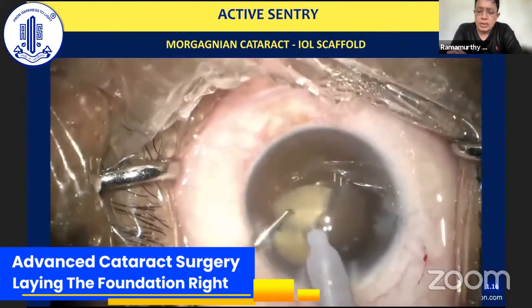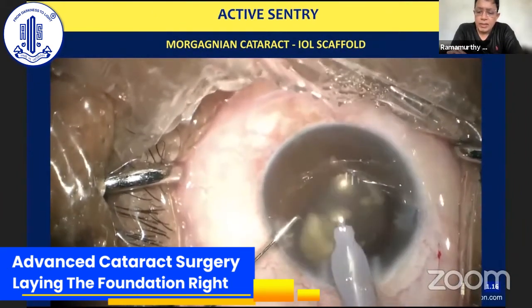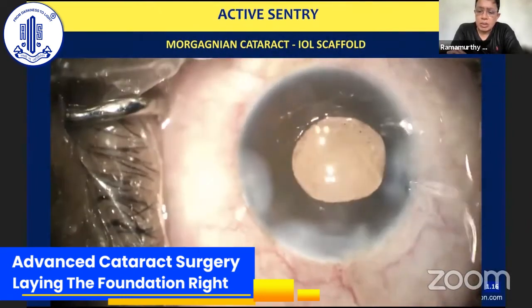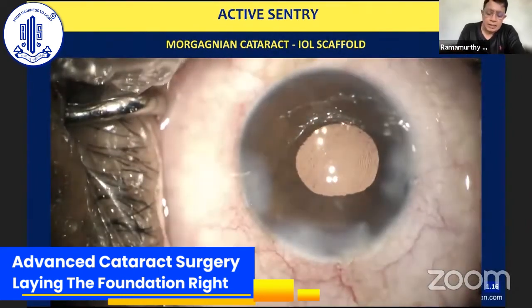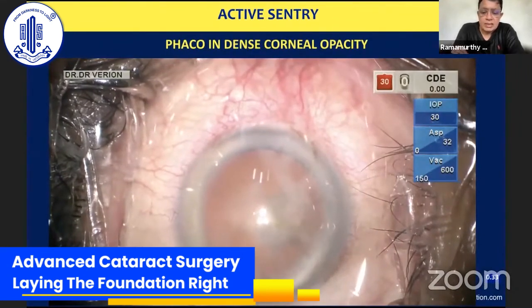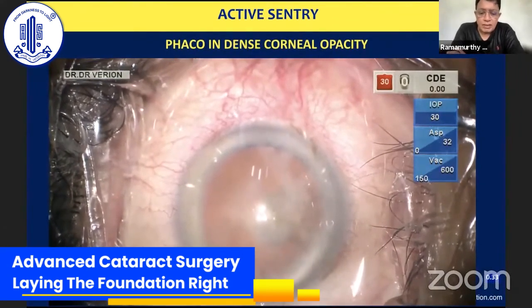Of course, it's needless to say, there's frequent filling up of dispersive viscoelastic into the anterior chamber so that the endothelium gets protected right through the surgery. And that's the end of surgery. And I think last of my videos, which essentially just shows you the confidence levels that you have.